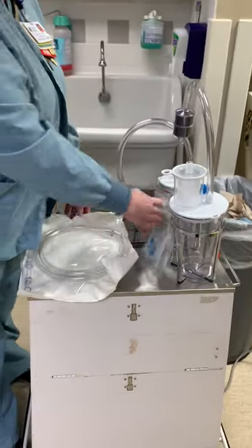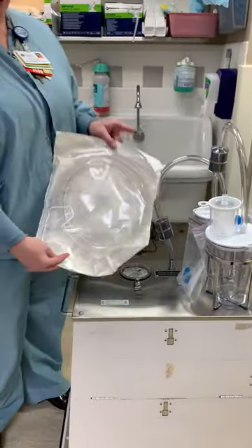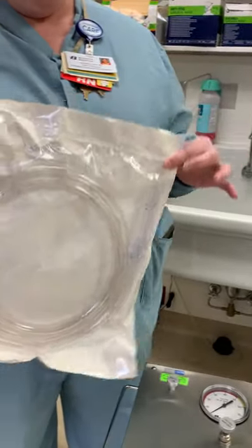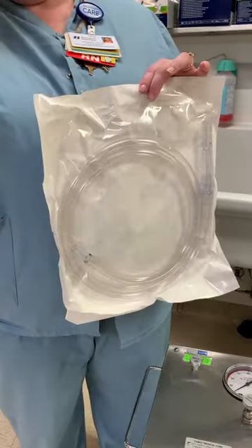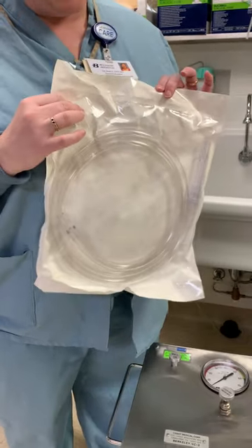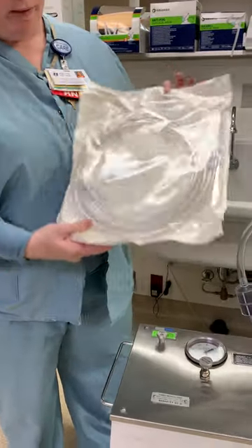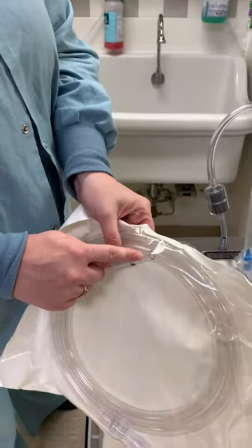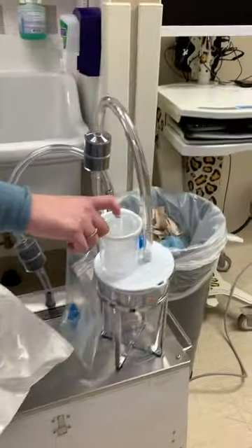And then you will have this tubing — there's some on top of the cart. You will hand this off to the sterile field. You will also get a curette, which we'll show you in just a minute, and hand that off. They will give you this end of the tubing to stick in here.